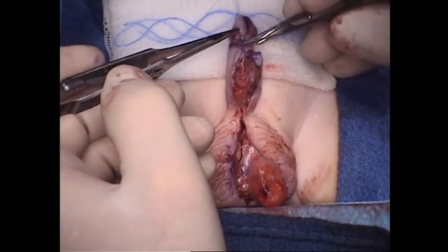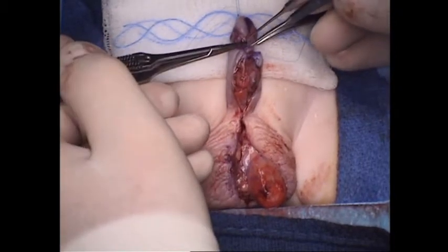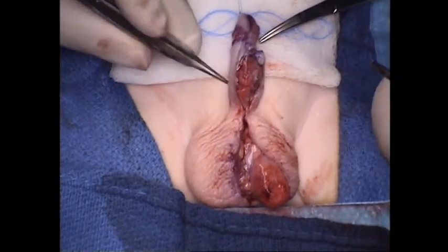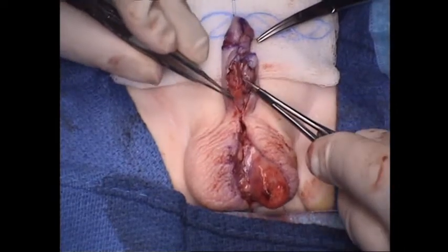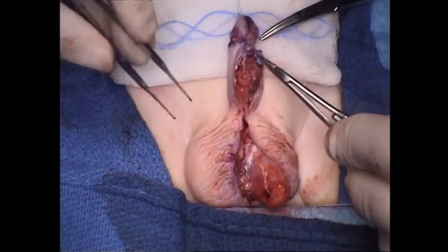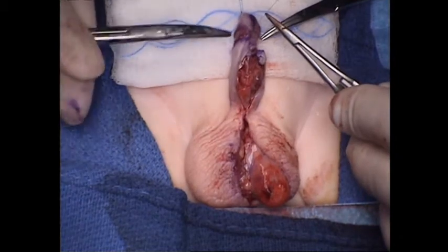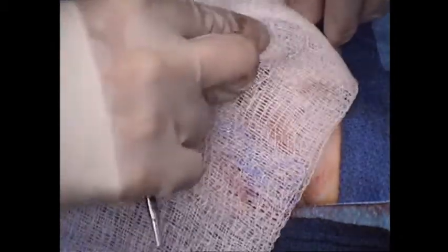So we have a nice, beautiful piece of ventral skin here from flaps that we've, in essence, mobilized from the back. You remember our native meatus was down here. So this was the only ventral penile skin that we had when we started the case, this little bit between here and here. So all of this has been mobilized around from the dorsal and lateral surface of the penis.